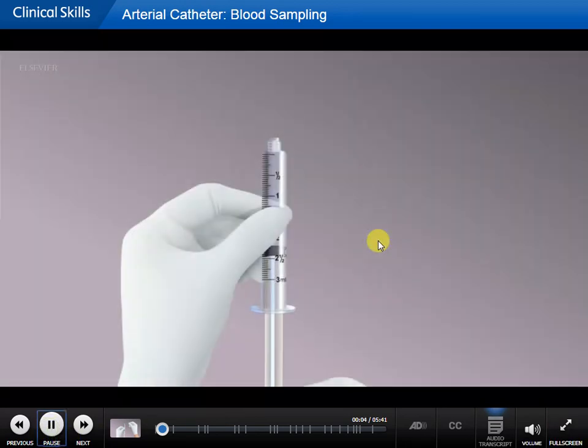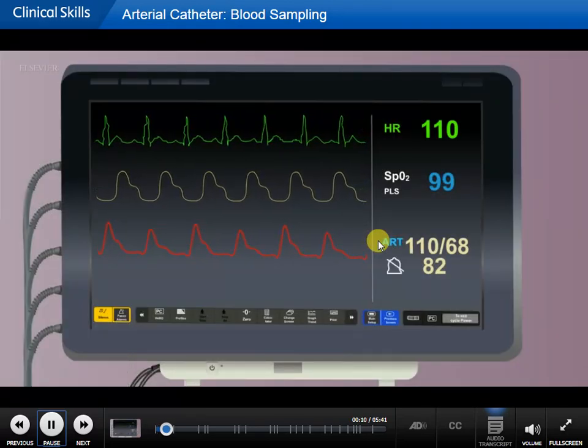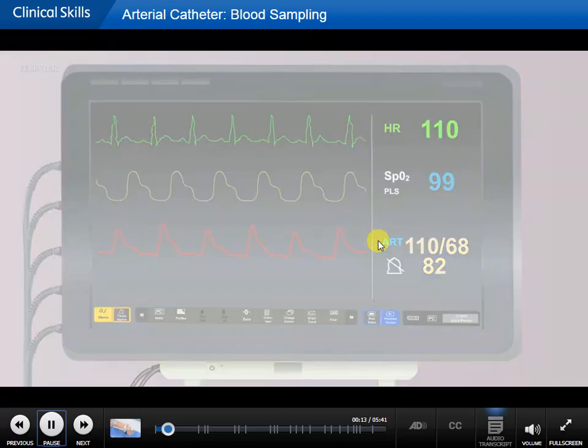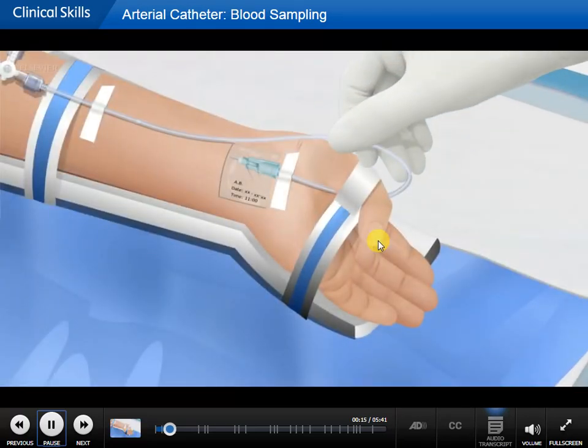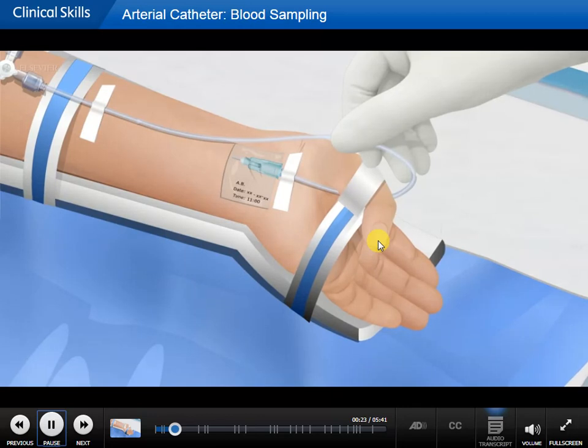ABG kit and use the plunger to eliminate excess heparin and air from the syringe. Suspend the arterial pressure monitoring alarm. Trace the tubing or catheter from the patient to point of origin before connecting or reconnecting any device or infusion, at any transition, for example, new setting, and as part of the handoff process.